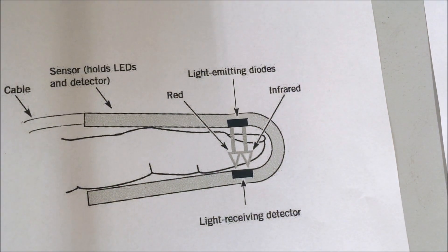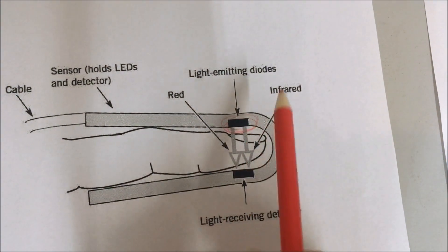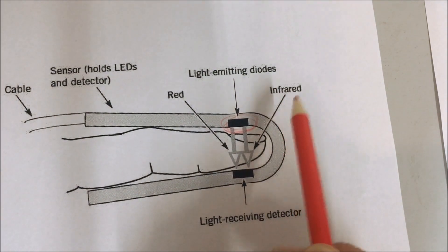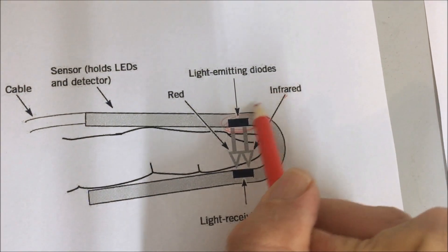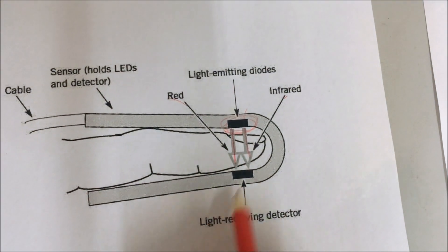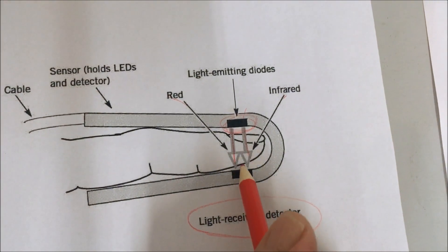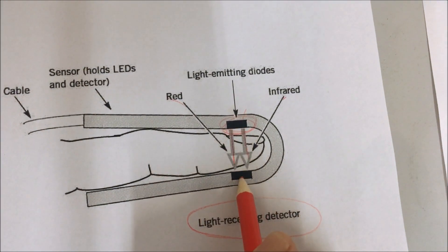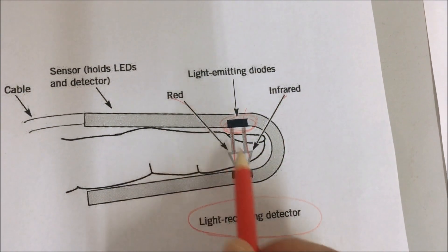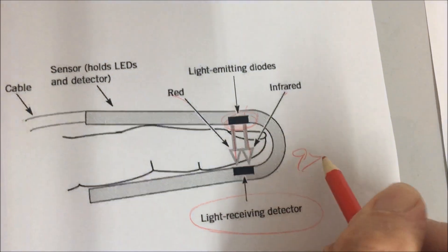The pulse oximeter emits light through diodes at the top of the device. The infrared light and red light both shine through the finger. On the opposite side of the pulse oximeter, we have a receiving detector which measures the amounts of infrared and red light, and it comes up with a percentage reading.